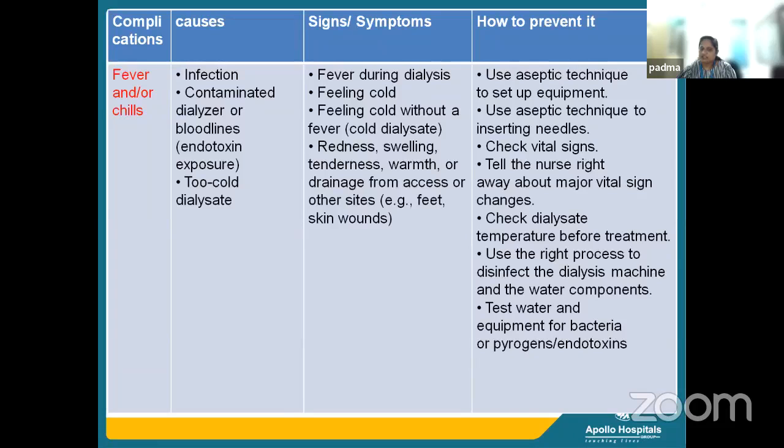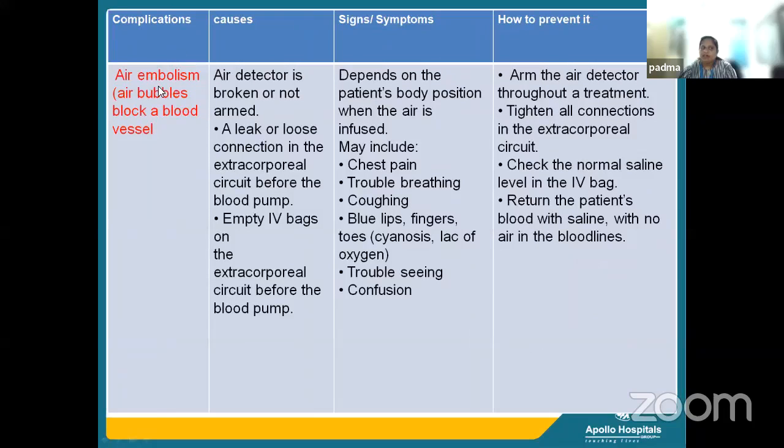Use the right process to disinfect the dialysis machine and the water components, and test water and equipment for bacteria or pyrogens and endotoxins. Air embolism. Another complication is air embolism. Air bubbles can block blood vessels.